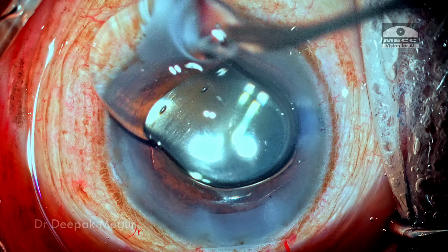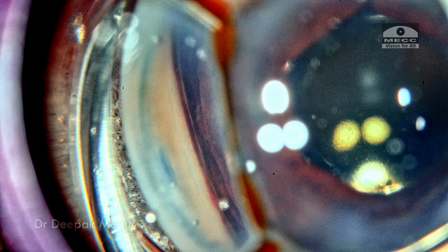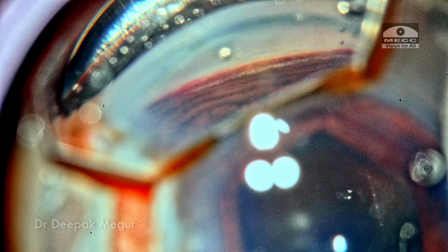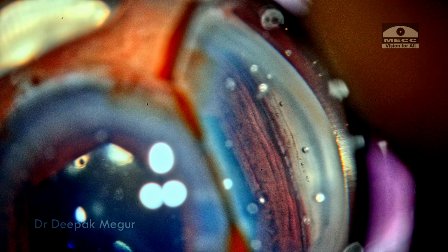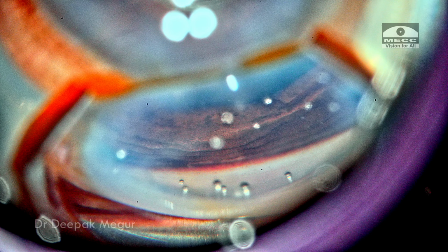Now is the time to go back and assess the angles. So I'm going to go in the same order which I had shown preoperatively. And you can see in this quadrant, the thick pigmented trabecular meshwork is very easily seen now. And similarly, in all the other quadrants, the angle opening is dramatic. So let us look at these pictures before and after lens extraction combined together.